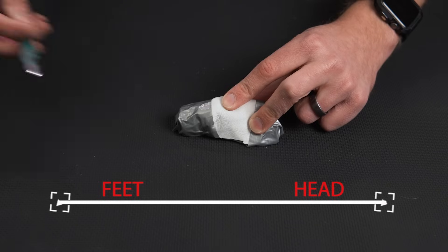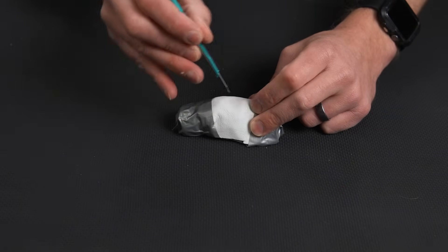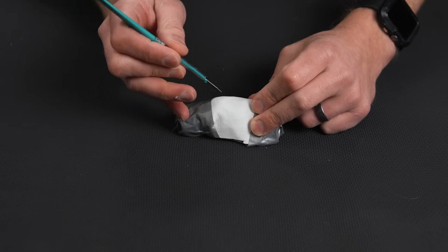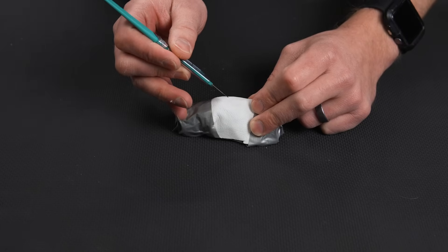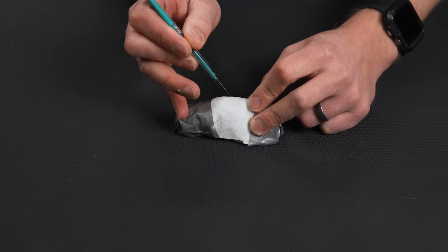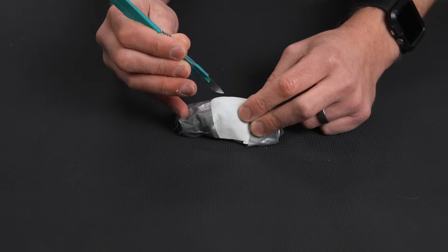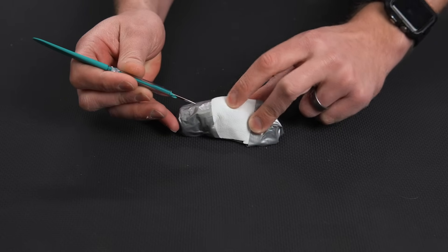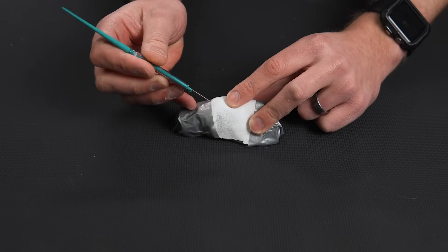I'm then going to take my scalpel and instead of making a first incision through the skin and a second incision through the membrane, this one is one incision through the membrane and the skin at the same time. The theory behind this is that this will allow me to mitigate any issues that might arise once I cut through the skin if there's a lot of bleeding. I don't have to rely on touch to find that landmark. I have the landmark, I can see it, and now we're going to use this.